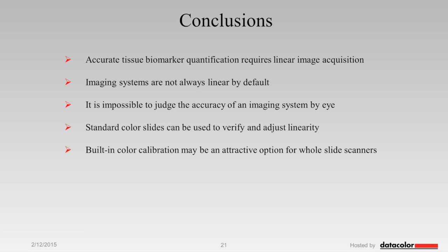as I hopefully demonstrated to you convincingly. And something I would be looking forward to in the future, if some of the manufacturers might be listening in today, is if they could consider integrating something like this into their software, so that you can create a calibrated environment every day by default by using the slide scanner. If that's integrated into their system, that would be a huge help for the workflow.